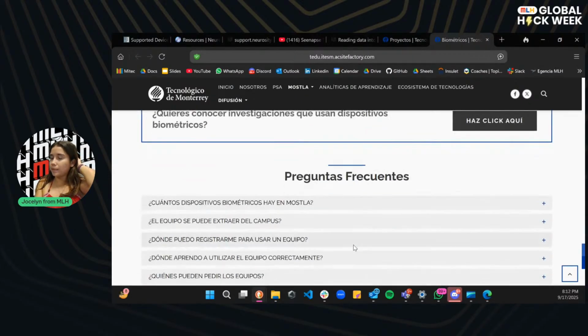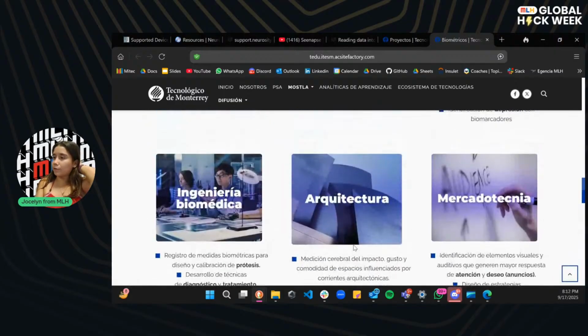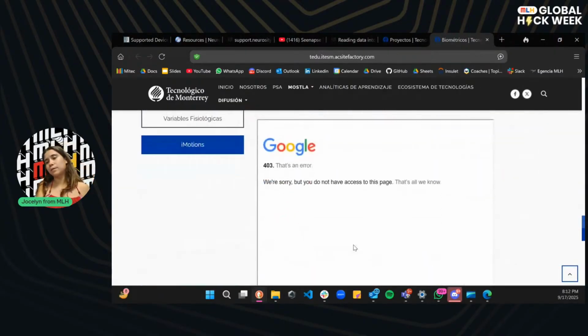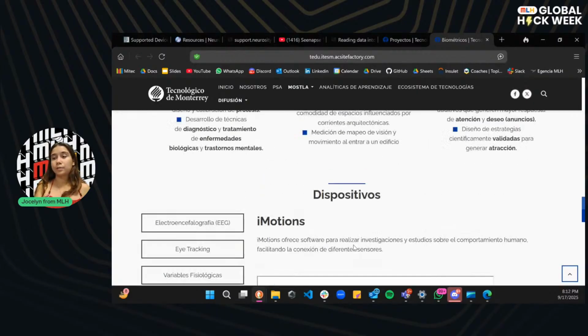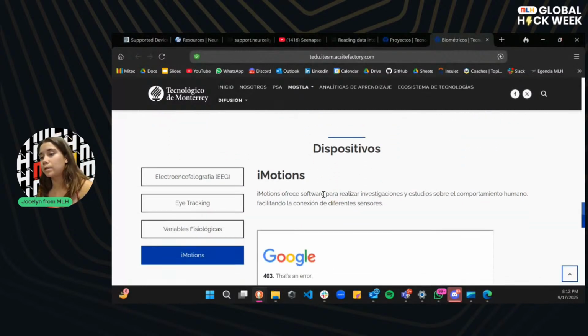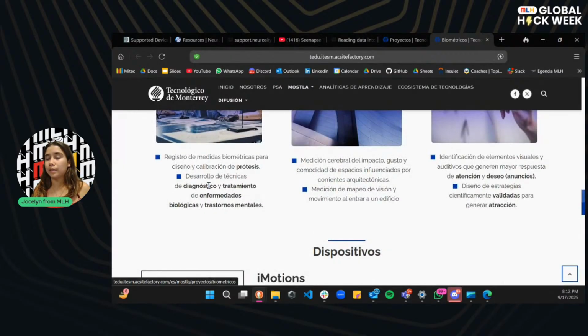And yeah, that's basically the hardware that I've used before. I honestly have used all of them. Looking forward to using more. The Crown is one of the newest acquisitions, and we also have more new headsets that haven't been documented on the web page. But that's one of the cool ones in there that you can also use.